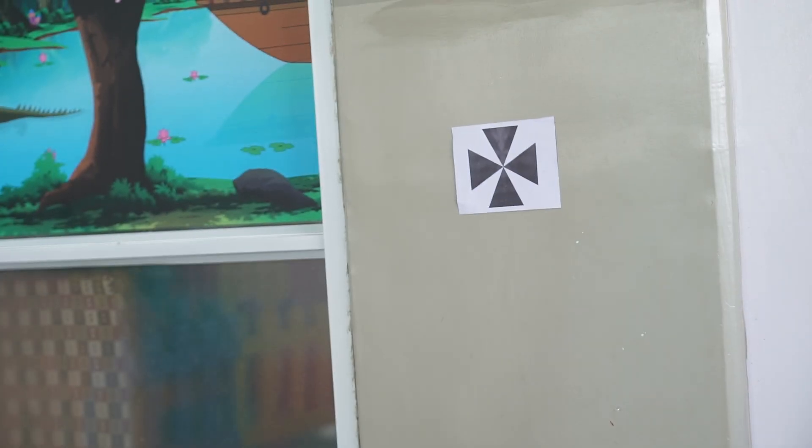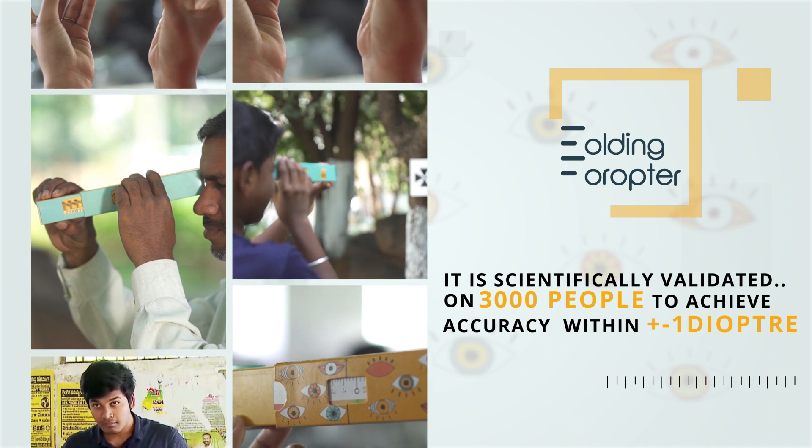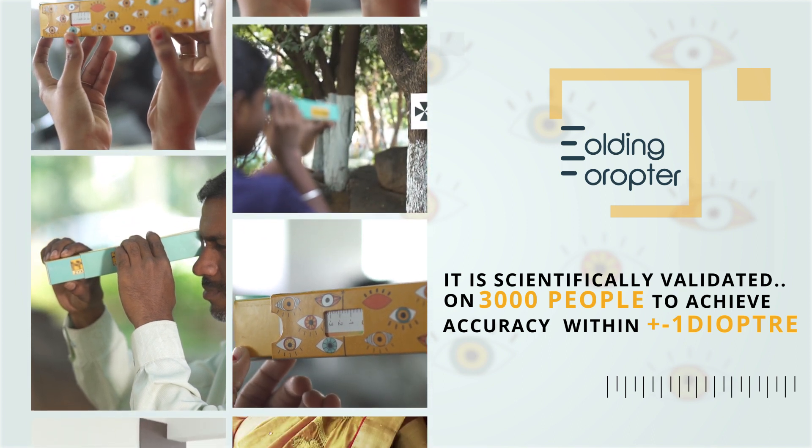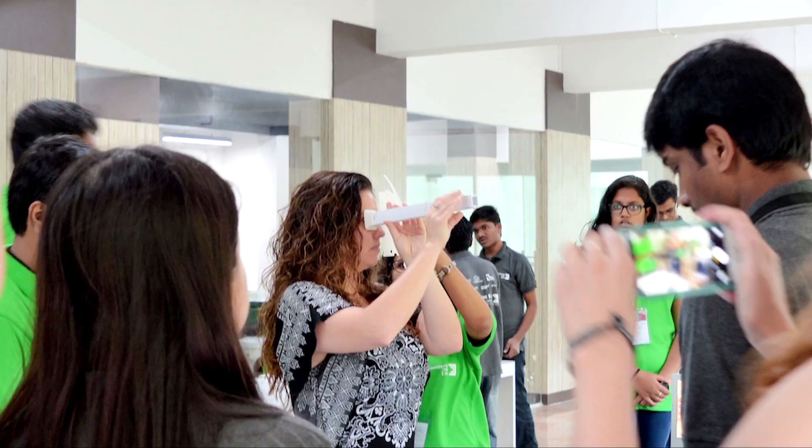To see a target clearly and get their approximate refractive power, it is scientifically validated on 3,000 people to achieve accuracy within plus or minus one diopter — the power to save vision in the hands of health workers, eyecare professionals, and school teachers.